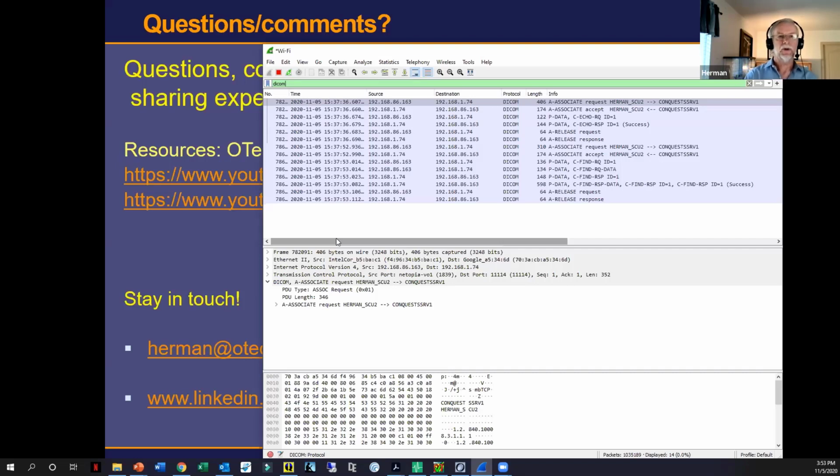If you have an encounter-based workflow, there are multiple options. I remember one of the presentations from the Mayo Clinic from Ken Persons, I think is his name. He gave a very good presentation about encounter-based workflow. It was in one of the SIIM presentations. You can probably go back and find it. But he gave 5 options for encounter-based workflow. He said, well, for ophthalmology, we do this. For cardiology, we do this. One of the options would be, we take the images and we merge them later at the EMR because we create a dummy order. Another one would be, we create a worklist dummy, or another option would be, and so on and so on.